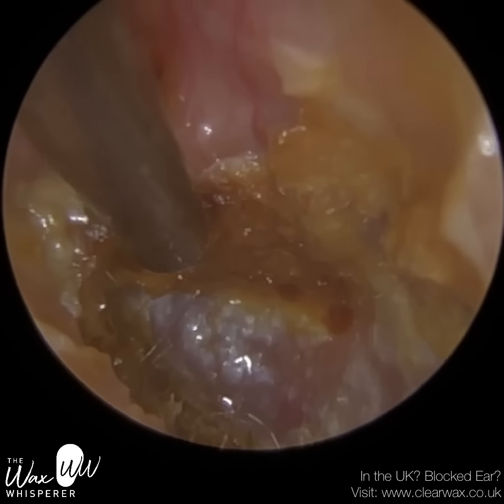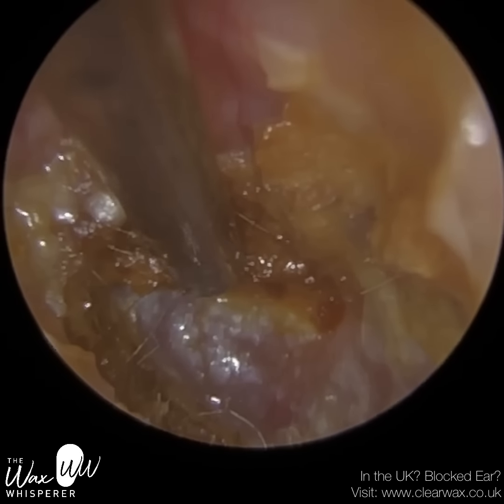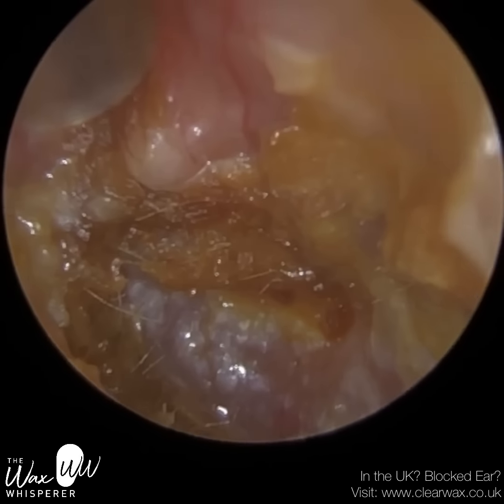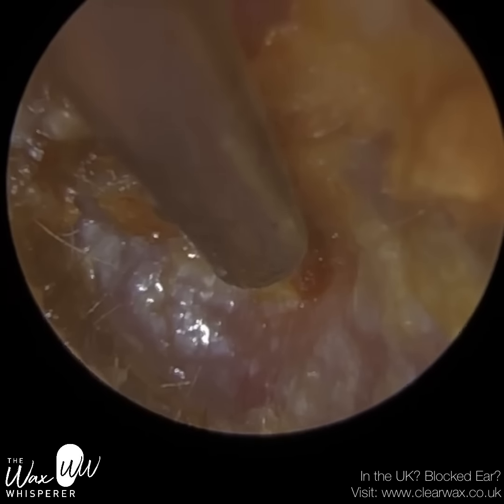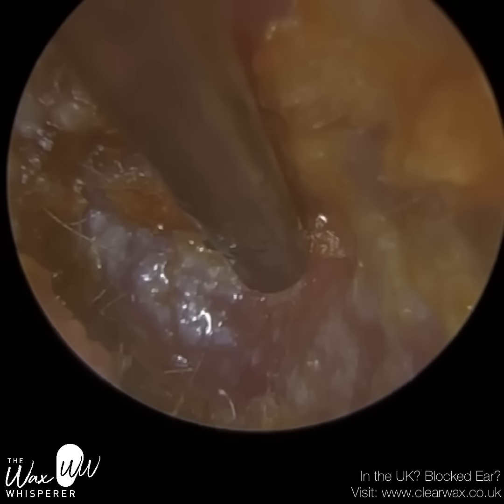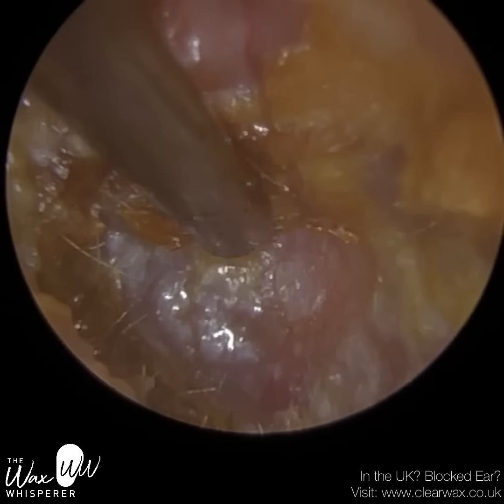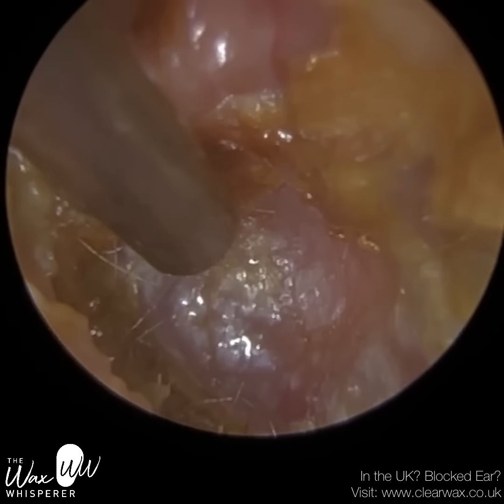In the meantime, I recommend some nasal drops for children. The typical nasal sprays are steroid-based and are not suitable for children. And we've recommended the Otovent nasal balloons. It's a balloon that you inflate using your nose. And so you block the opposite nostril that you're using it in, closing your mouth, you blow into the balloon, inflate the balloon using your nose. So the balloon comes with a nasal capsule, an inserter, and then as it inflates to the size of an orange, you just swallow, and it helps to force open the eustachian tube and pop the eardrum back out, and to allow some fluid to drain.